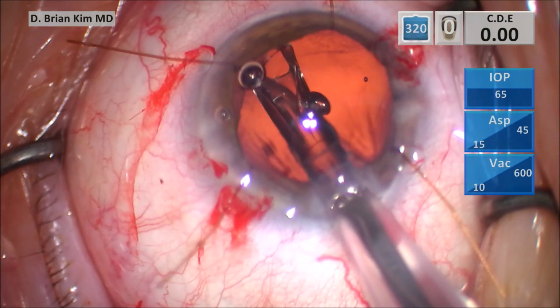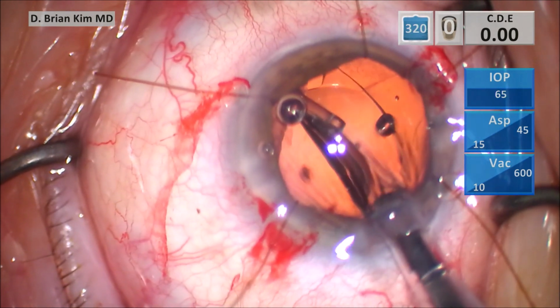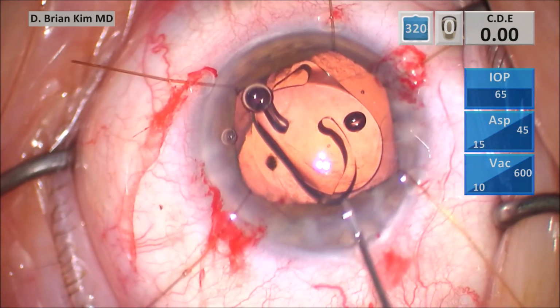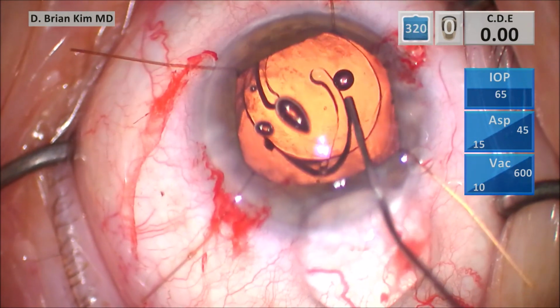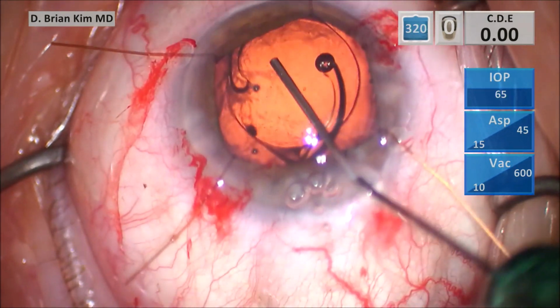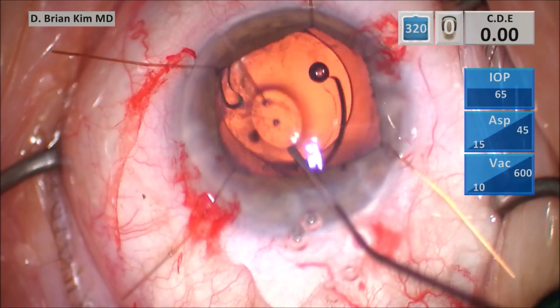And what I love about the single piece acrylic lens, especially the Alcon lens, is that it's very sticky. Because of that, one, it opens up very slowly so that you have time to position the haptics the way you want to, but also these haptics are extremely sticky. Because of the lens design and material, these lenses, especially the ones in a toric form, don't tend to rotate, and that's why it's such a stable toric platform.